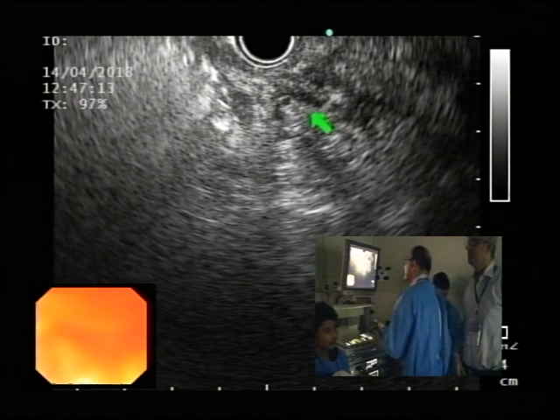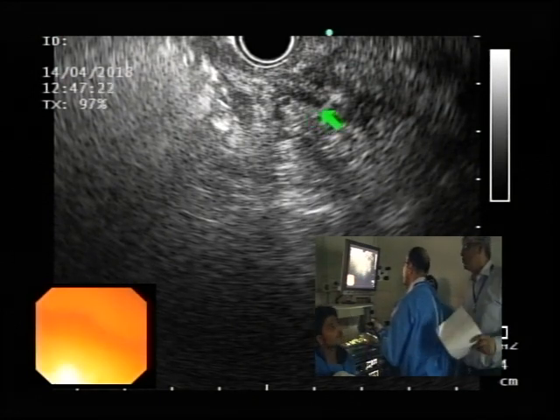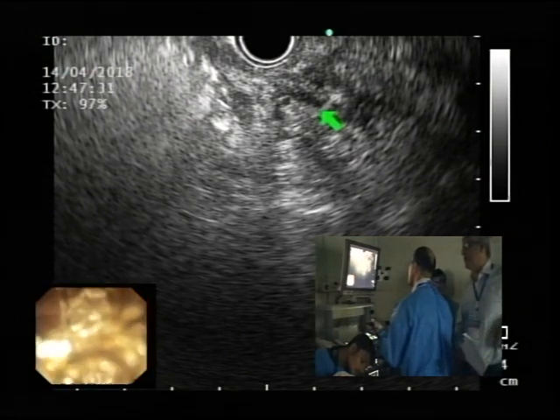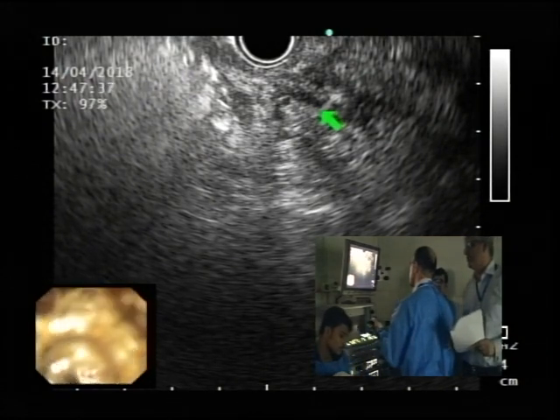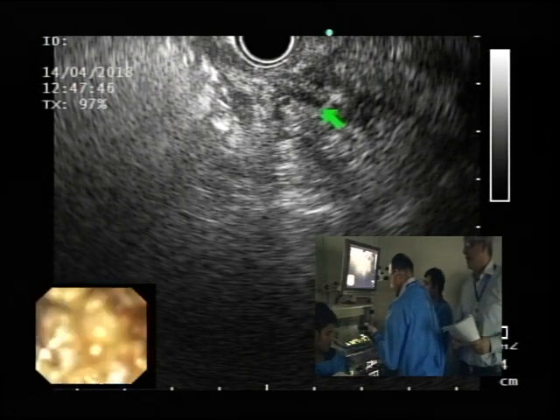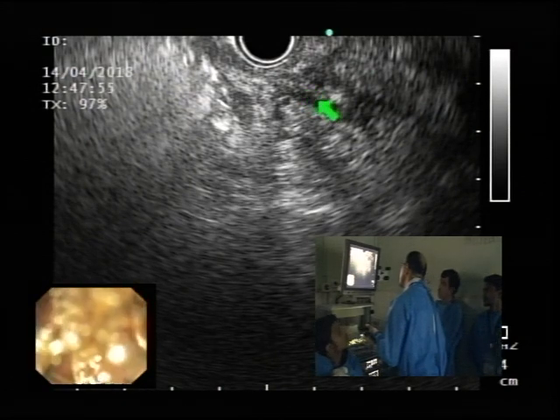Initially, when the case was being presented, somebody said there were intramural nodules as well. Yes, that was on the CT scan, not on the EUS. The EUS was done on the 18th of February, and Khaled may recall he was there; we were doing the ERCP workshop. On that, there was a question mark on the possibility of something in the pancreatic duct, but not confirmed. The patient has been presenting with abdominal pain. So the differential there was chronic pancreatitis, and the ampulla was normal, so it's unlikely to be neoplastic. And this is actually, I finally found it: this is the ventral duct, and this is the bile duct.